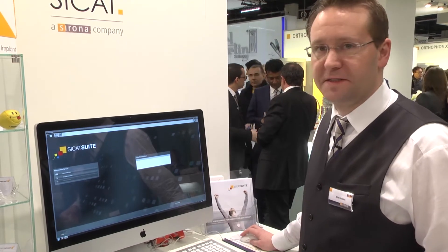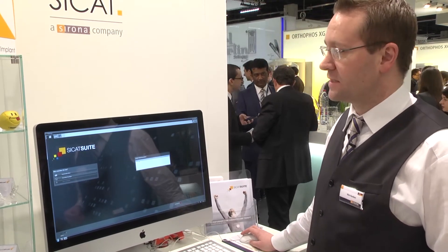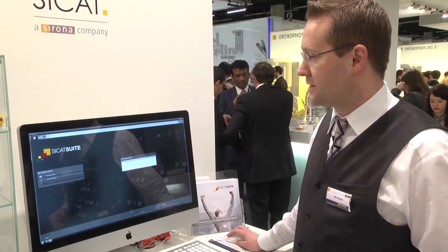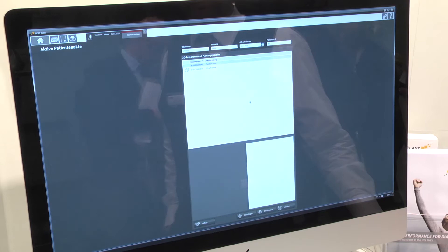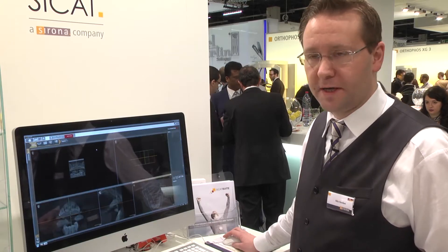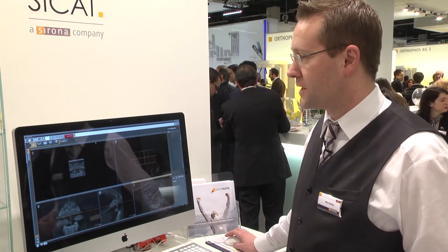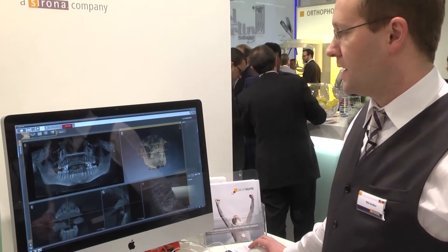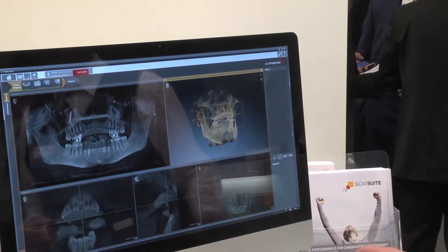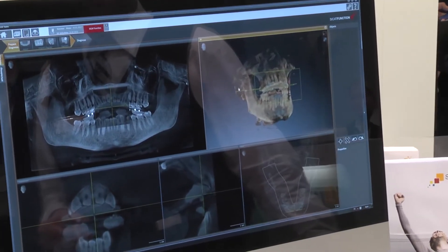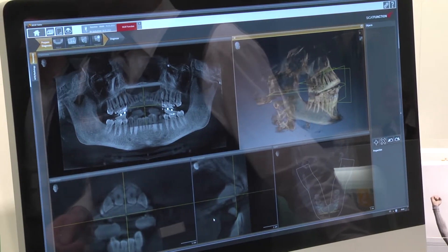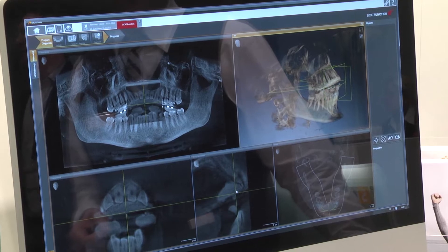First of all, I select the data set which is integrated into the SICAD suite. We prepared here a data set for the demonstration. I open it up and it loads very quickly into the 3D software. You see first of all the typical views within the software: the panoramic view on the left, the 3D view of the Galileo's data on the right, and some slice views at the bottom of the software.